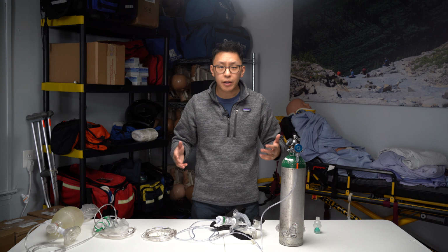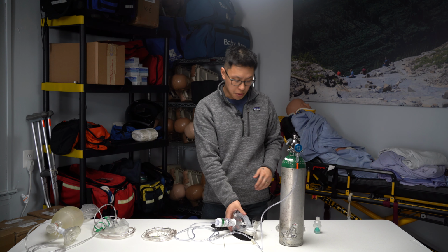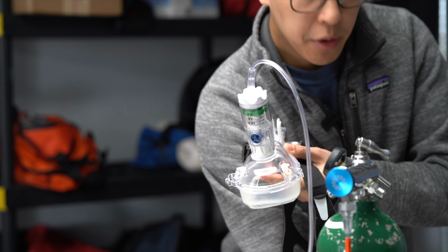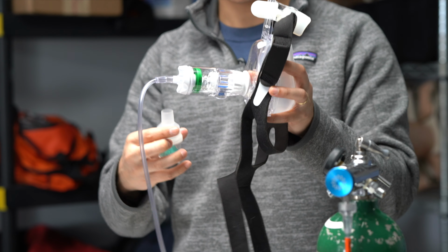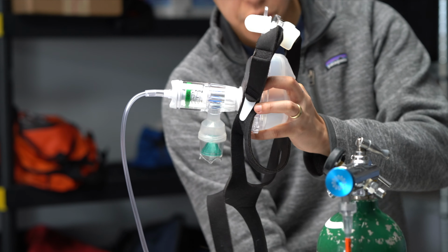And upon reassessment, maybe after 2 rounds or 3 rounds, depending on your protocol, it might allow you to escalate to a CPAP that has a fixture, a one-way valve right here, that you can apply a nebulizer chamber to. That one-way valve has to be facing down, and we can apply this neb kit to that chamber.